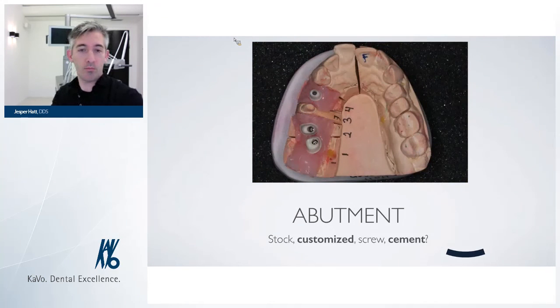Today we might be able to do a little bit better grafting than this, but this was the position that we got the implants in from the hospital, and we had placed our implants, numbers 1-4.